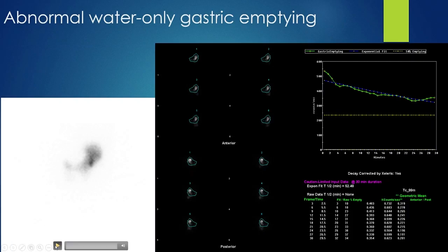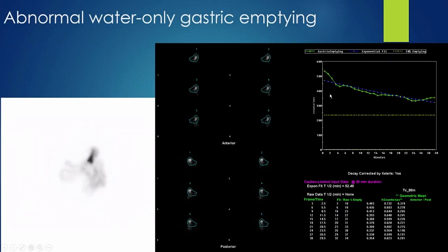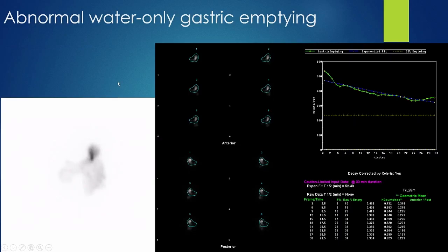And here's an abnormal water-only study. Clearly this did not empty like the normal study, with a T½ of over 50 minutes — very delayed and abnormal. Notably, this patient had a normal solid emptying study prior to this, illustrating that the two studies can diverge.